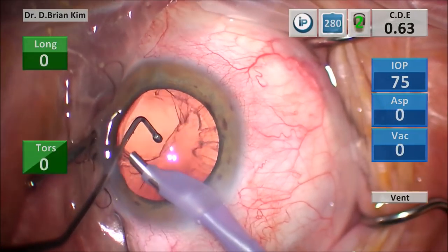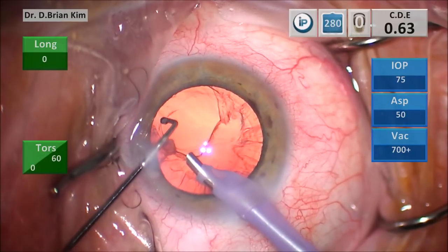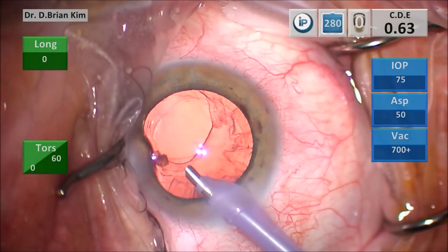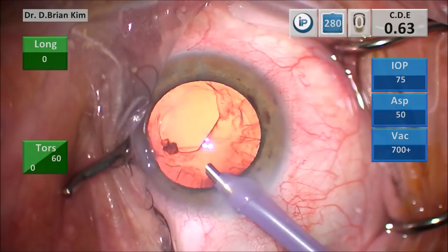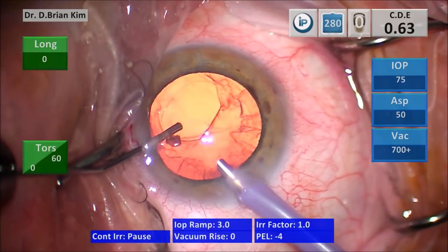And so at this point, you have to gather yourself. I removed that last fragment, and now at this point, what are we going to do? Obviously, you want to pause and think about what you're going to do. You don't want to come out with the phaco. You don't want the chamber to collapse and invite vitreous into the anterior chamber. At this point, I don't believe I broke the hyaloid face. I don't think there's any vitreous in the anterior chamber yet.